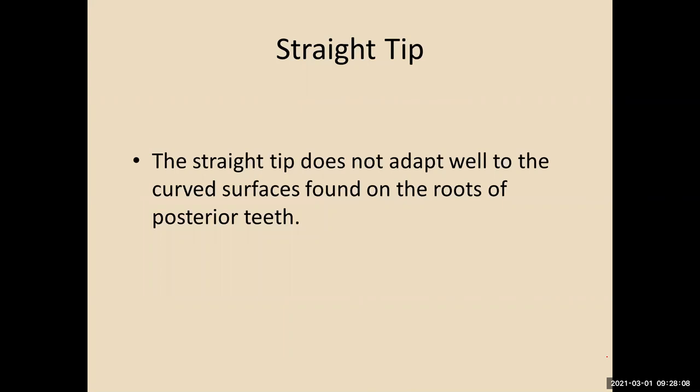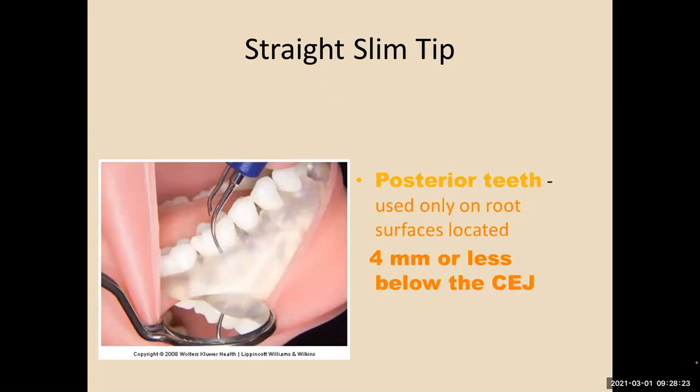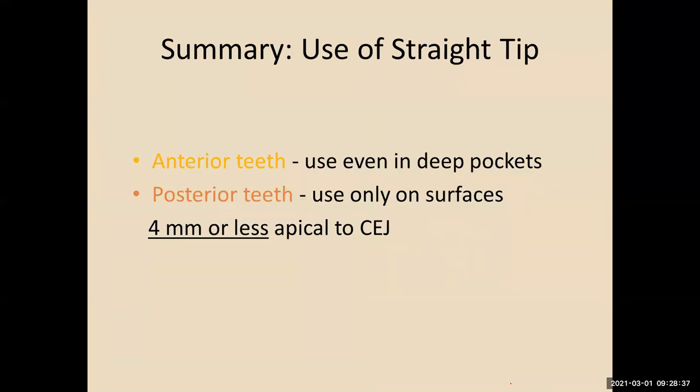The straight tips do not adapt well to the curved surfaces found on the roots of posterior teeth. But they're great for anterior teeth, no matter how deep the pocket is. You need to have a shallow sulcus or pocket depth to use the straight tip in the posterior area.